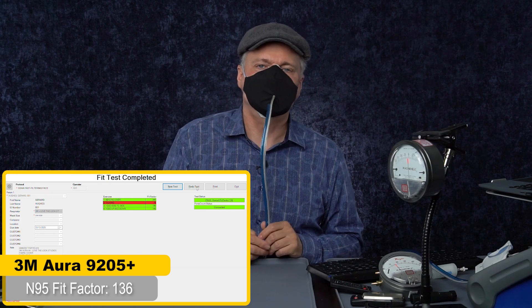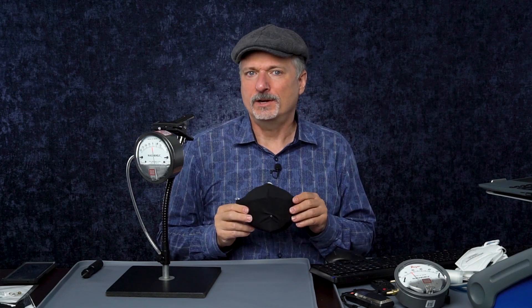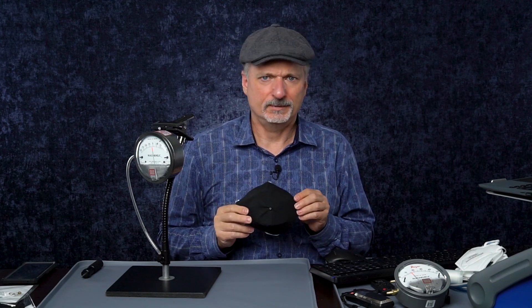136 — really close to the last score I got, a little bit lower, but maybe not statistically significantly lower. The Aura was able to pass a fit test on me even with the cover. I'm pretty happy about that. But I want to know if there is a consequence to wearing this — is it less breathable? It felt OK, not too bad, but I want to see if I can quantify that.